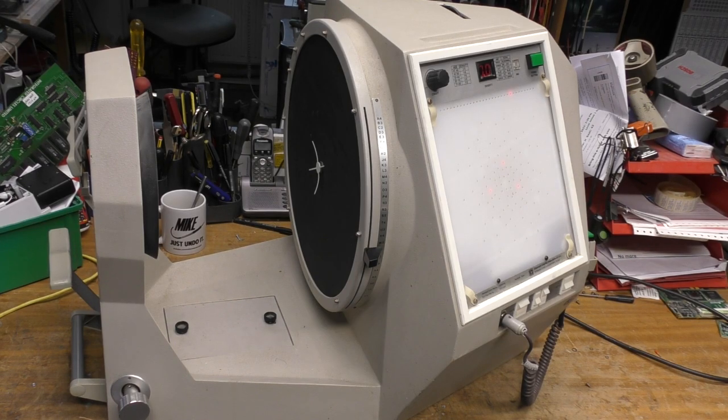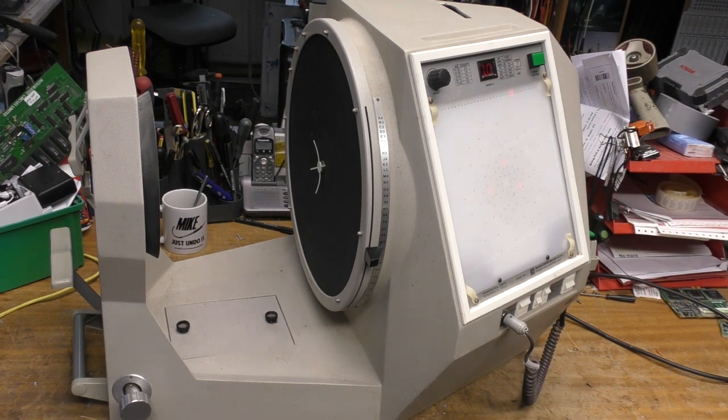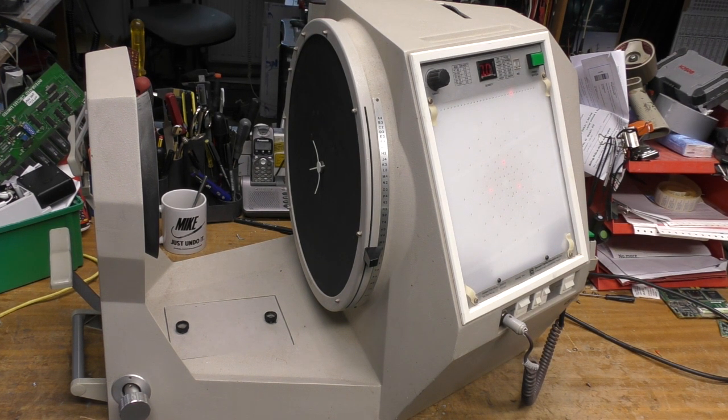Hi, so today we're going to take a look at this. This is a Friedman visual field analyzer made by Clement Clark International. This was given to me by Sam, otherwise known as Look Mum No Computer. He's done a brief video on this as well. I'll link it down below.